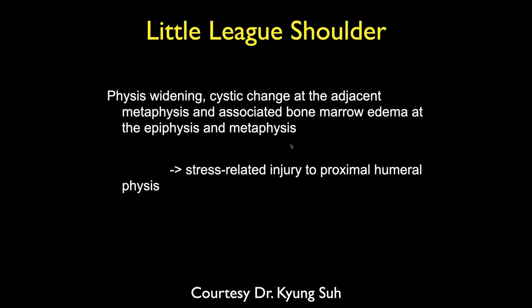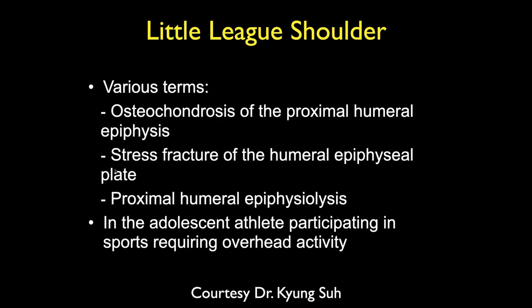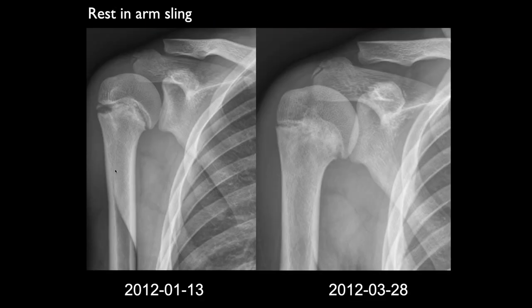This should never happen — it just should not. Here is that patient with the abnormal growth plate. The arm was put in a sling on 1-13-2012. On 3-28-2012 — ten weeks later — there's significant healing in the area of the growth plate injury. The thing about this healing is that the growth plate is closing, so this arm is not going to be as long as the other one. That's pretty bad at this early age.